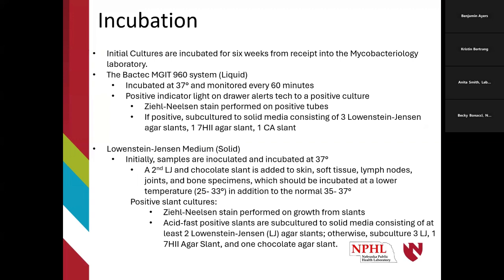In this particular case, when the indicator is positive, we would typically right away do a Ziehl-Neelsen. So that's our definitive stain. So many times we have mixed cultures, we have pure cultures, we might have just bacteria only. So we'll do different things for these different scenarios. If it's just bacteria, we'll re-decontaminate it again.